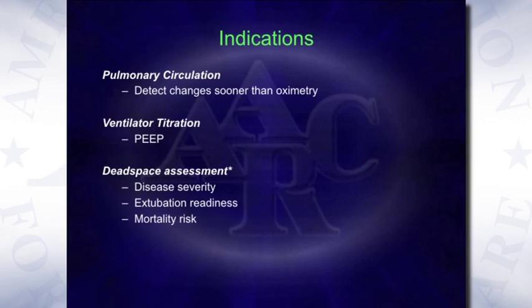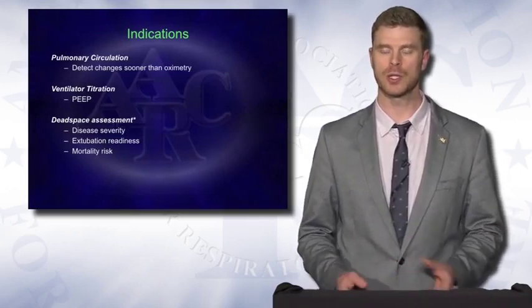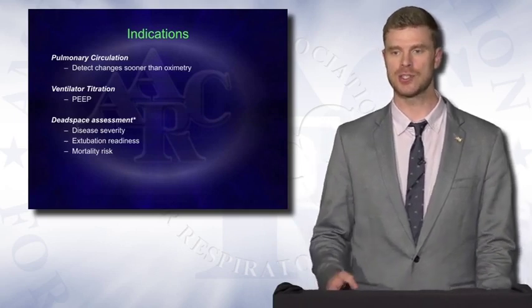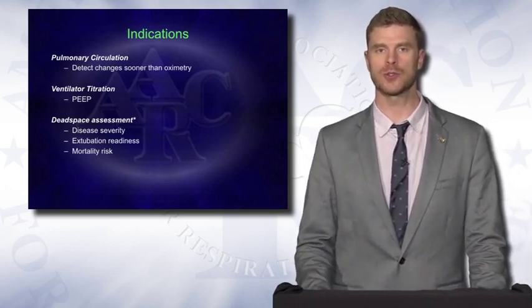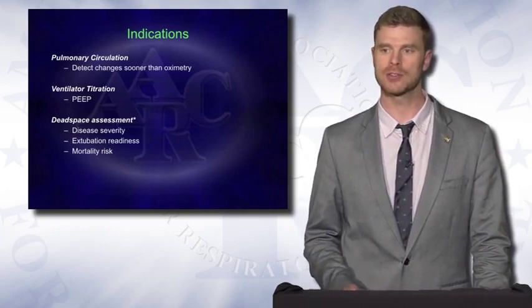Although there's not a whole lot of literature for this indication, I'm going to get into applying that in a few minutes. And number three, this is perhaps the best studied, was really using dead space assessment to detect disease severity, extubation readiness, and also mortality risk. And I'll give you a couple examples in the literature of those applications.